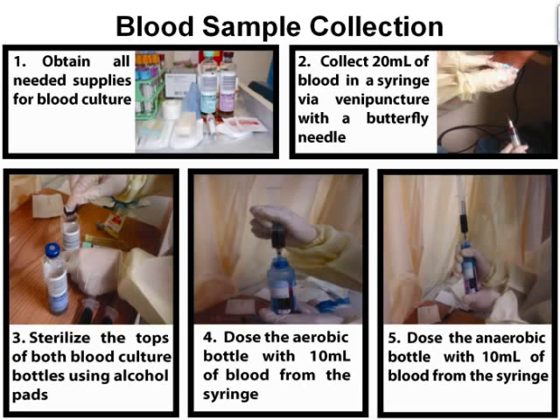Please note that while the collection protocol calls for performing venipuncture whenever possible, depending on the patient, it may not always be the best method. For example, in severely burned patients, venipuncture is not recommended due to the lack of innate barrier to infection and possible contamination. In this case, blood is drawn from a line, frequently an arterial line.